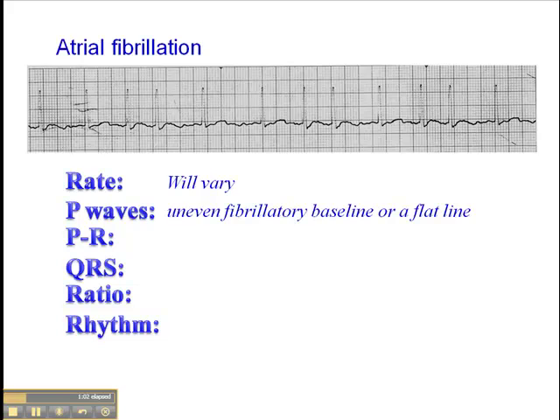What you may see in the place of P waves is an uneven fibrillatory baseline or a flat line. I would not use the baseline — you can see here it's a very uneven baseline — as the basis for making your interpretation of atrial fibrillation, because this can just as easily be muscle artifact from the patient moving or shivering. So fibrillatory waves are really non-diagnostic.